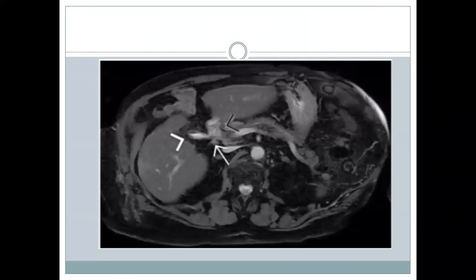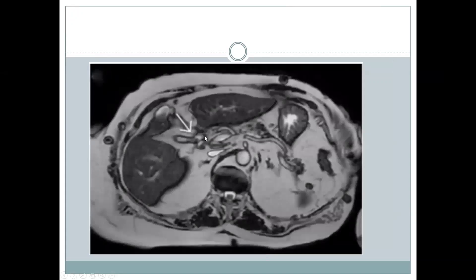The role of MRI is quite limited and we don't routinely use it. MRI might be used in a few cases where CT cannot be performed, or when the surgeon needs to know the fistula anatomy. This fat-suppressed sequence shows the fistulous communication between the duodenum and the gallbladder, and the T2 sequence of the same patient also shows this fistulous communication between the two.